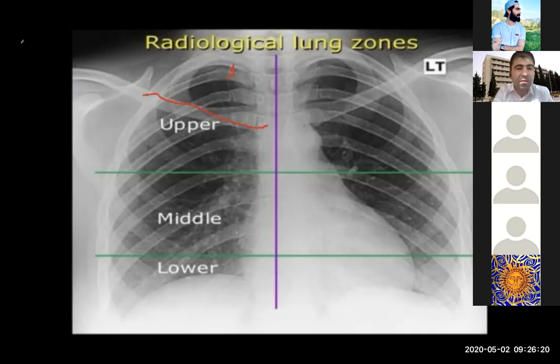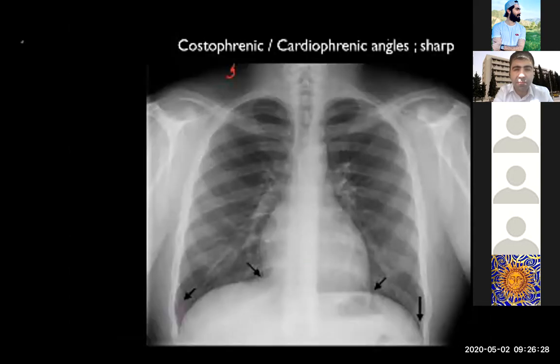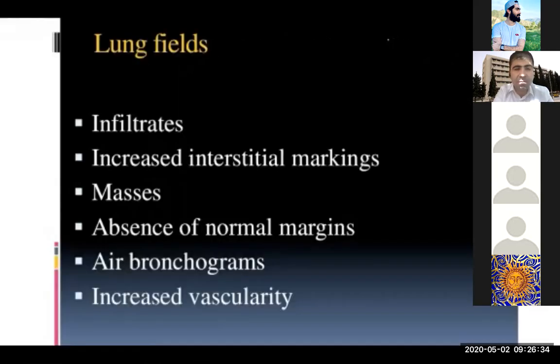About the lung fields, so Doctor, you are not sharing the screen with us. Yes, now it's working. Okay. So the lung fields.